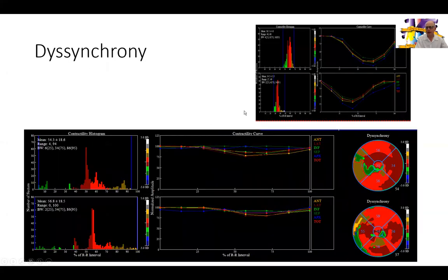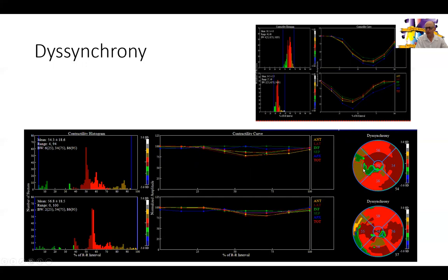Then we move to the dyssynchrony analysis. I kept a normal example on top showing normal synchrony at rest and stress, where all myocardial segments come down together with normal and synchronous contractility. In our patient, all segments are contracting at haphazard times in both rest and stress images with no evidence of significant contractility. The dyssynchrony polar map shows the septum is probably the worst segment for dyssynchrony — not an unexpected finding in patients with left bundle branch block.